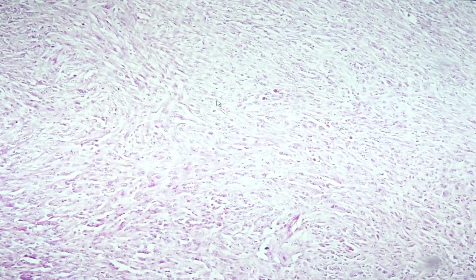Our last slide for you today would be slide 101. This is leiomyosarcoma.